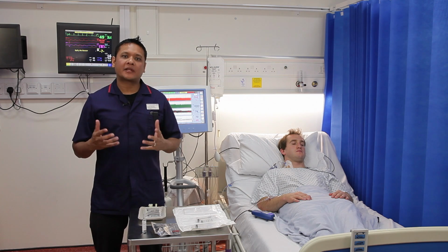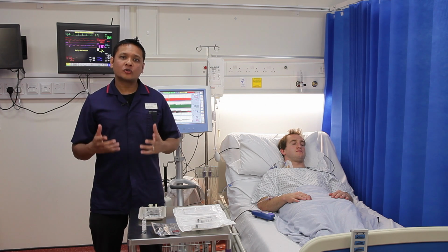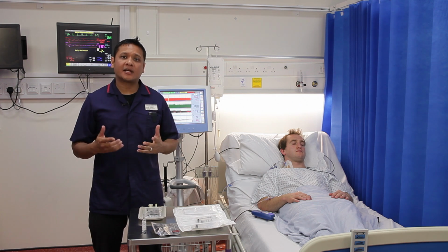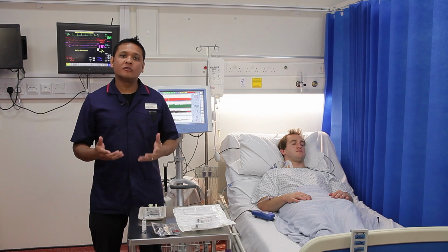It's worth pointing out that air bubbles in the sensor can not only affect the sensor voltage, but also how quickly the baseline stabilizes prior to calibration. Again, flush the sensor to remove any bubbles.